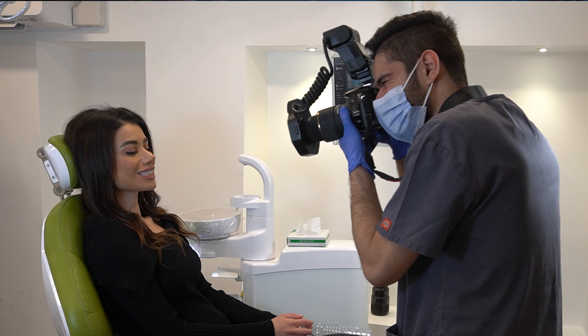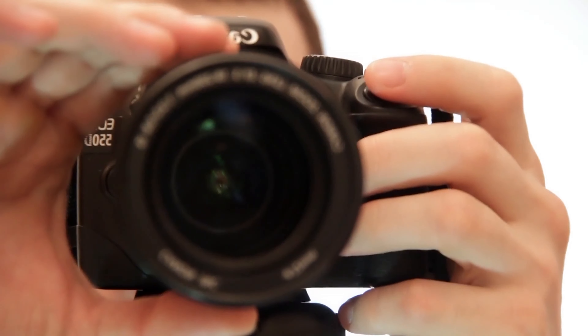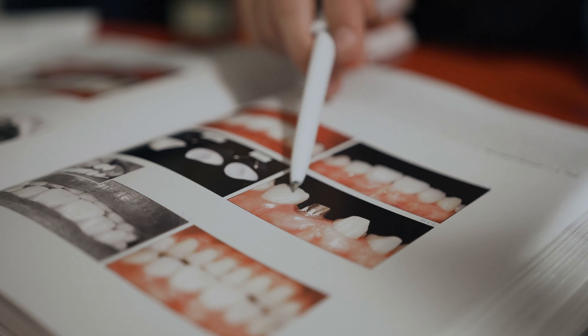Some of you might be in a practice that has a shared camera, but here's why I think you should get your own. If you have your own camera in your surgery right next to you at all times, you're way more likely to actually be taking photos rather than having to plan ahead and ask your nurse to get the practice camera. And once you've spent money on your own, you'd want to get your money's worth. Others in the practice might change the settings, which gets really annoying. You should see this as a long-term investment — you'll be using it for many years and it makes patient communication so much easier.